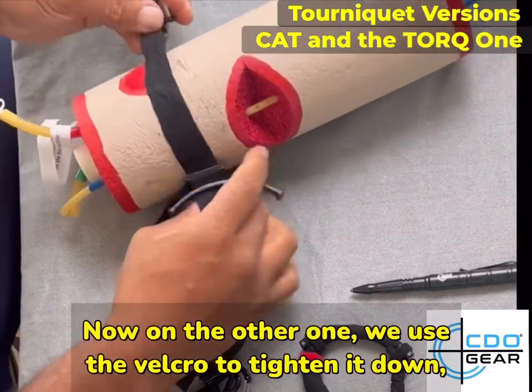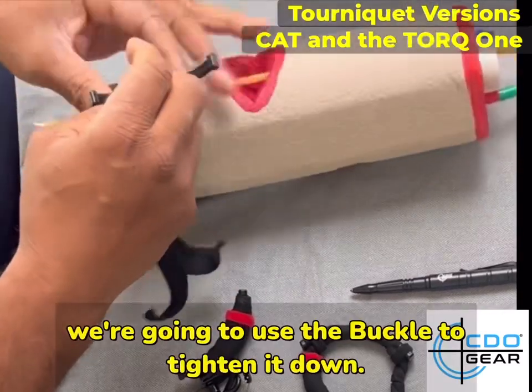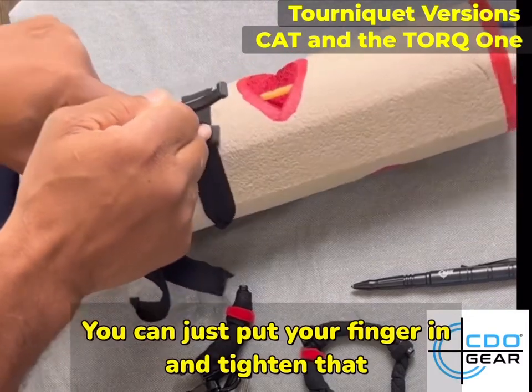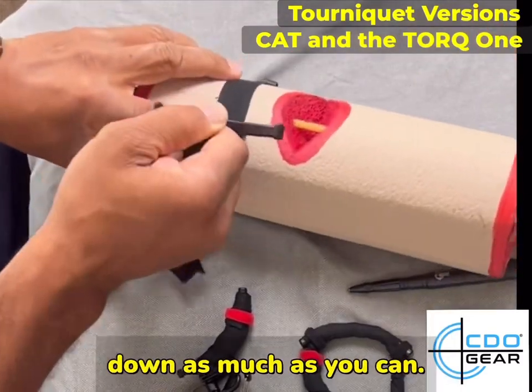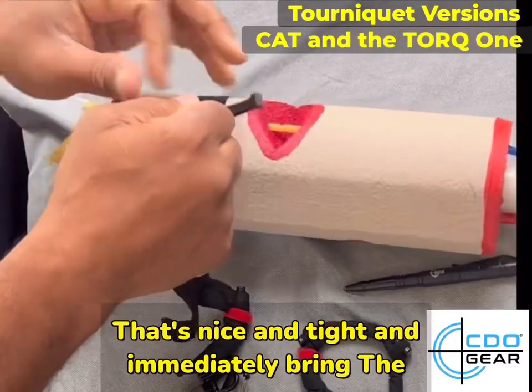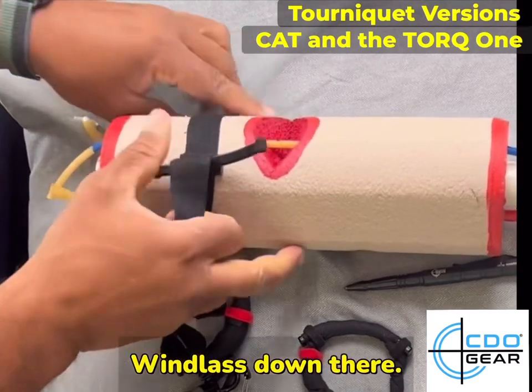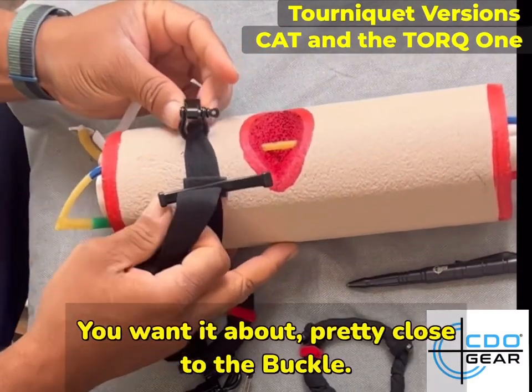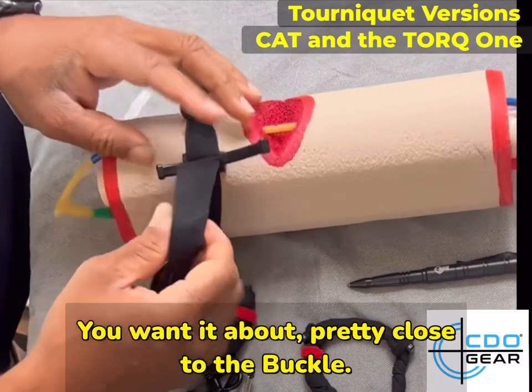On the other one we used the Velcro to tighten it down; on this one we're going to use the buckle. You can just put your finger in and tighten that down as much as you can. There — it's nice and tight — and immediately bring the windlass down. You can use the angle to put it in the right place. You want it pretty close to the buckle.